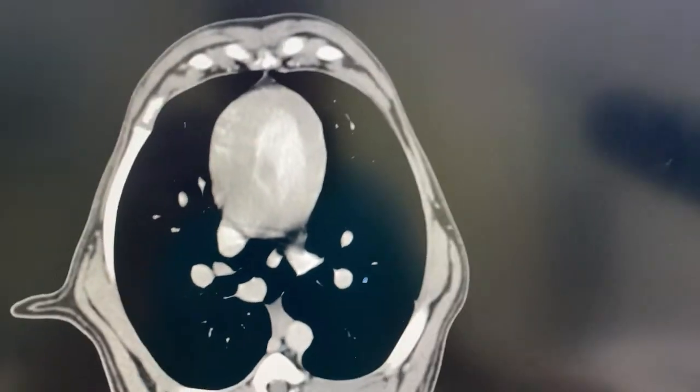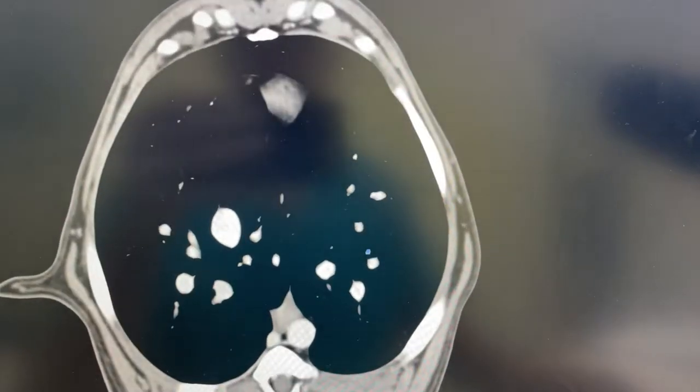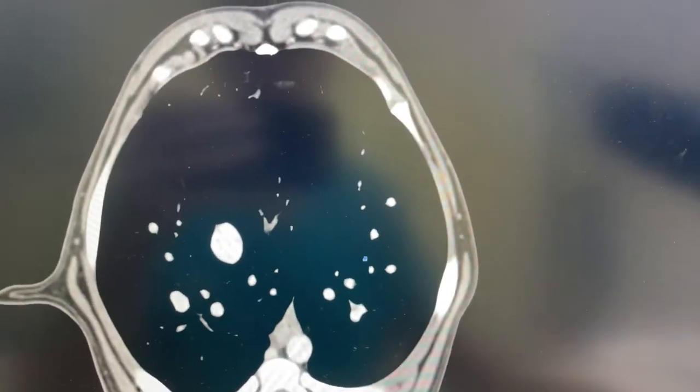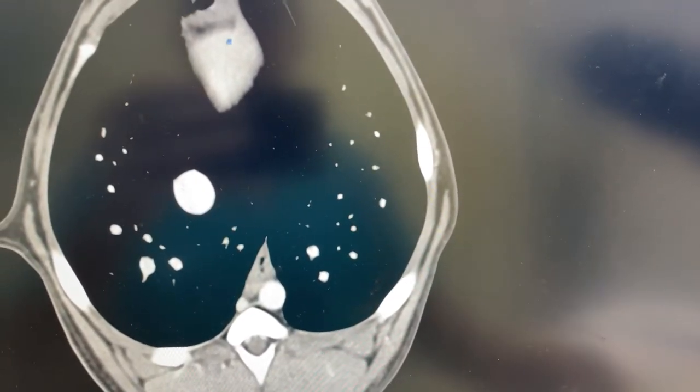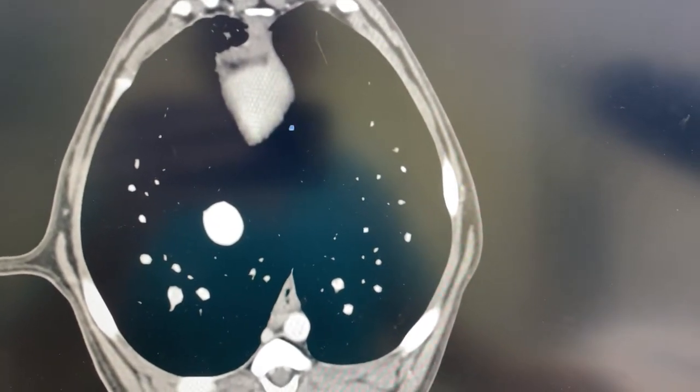Get a little closer view on that. And then we're heading caudally in the caudal vena cava. The esophagus is sitting there and you start getting a hint of the diaphragm and the liver there.